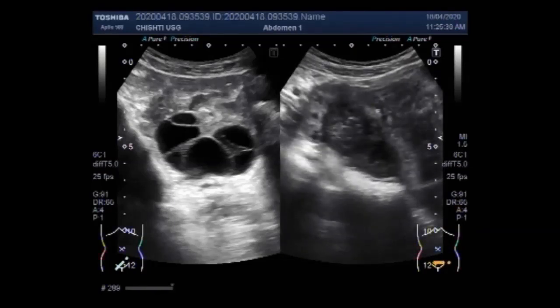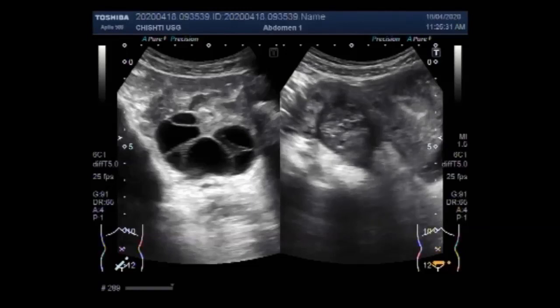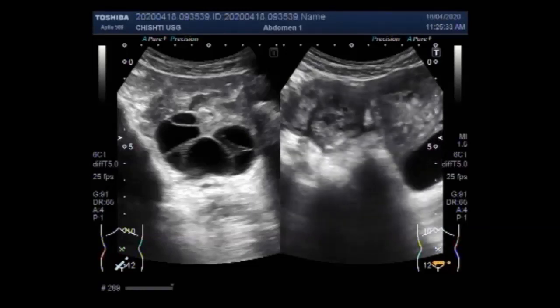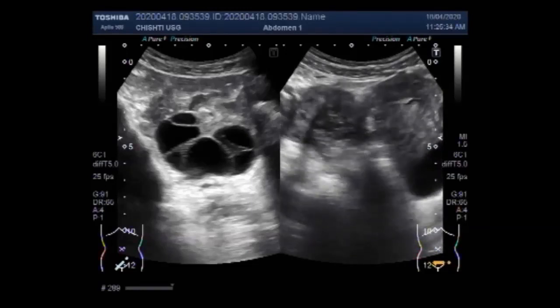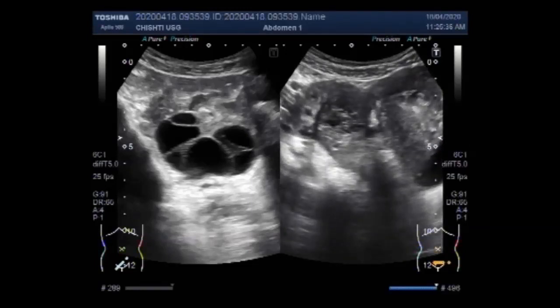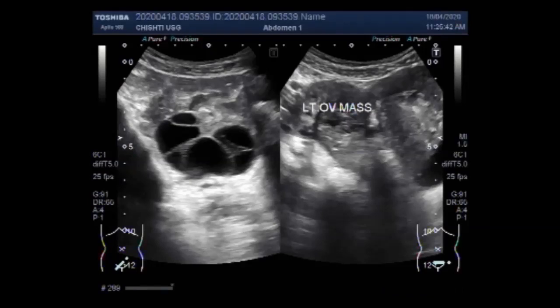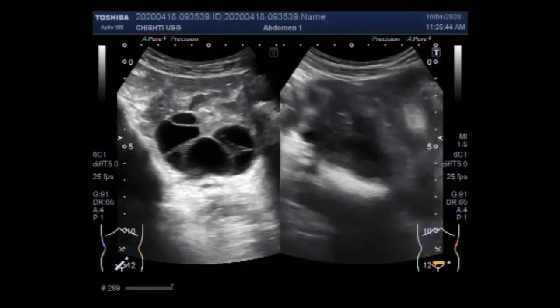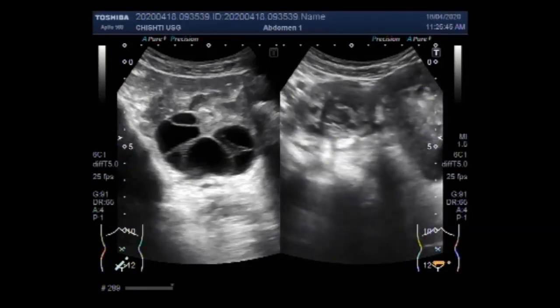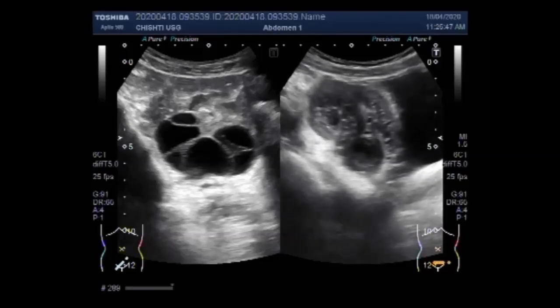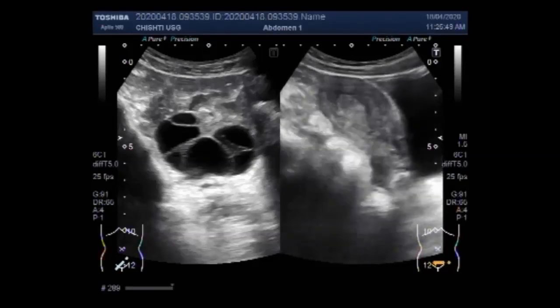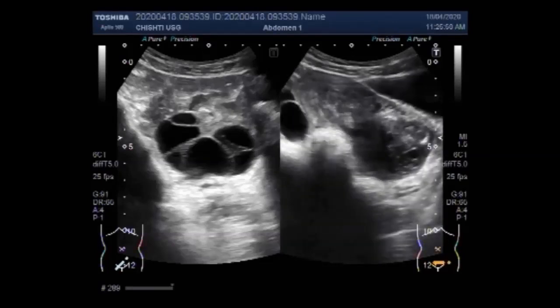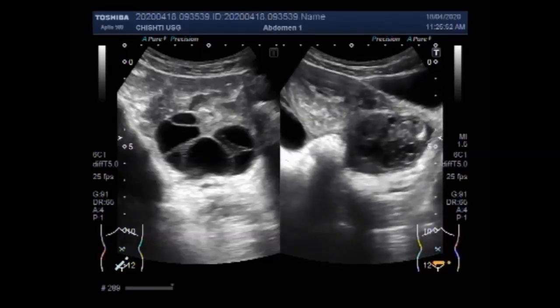Follicle sacs typically dissolve after releasing an egg. But if the sac does not dissolve and the opening of the follicle seals, additional fluid develops inside the sac, and this accumulation of fluid causes a corpus luteum cyst.